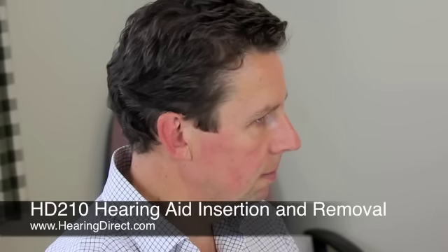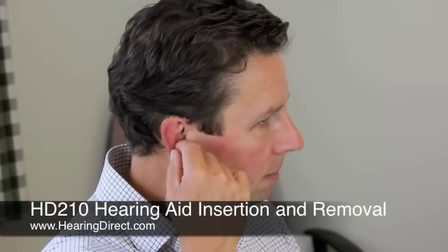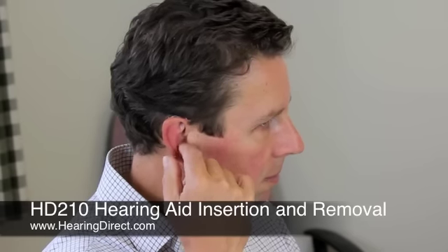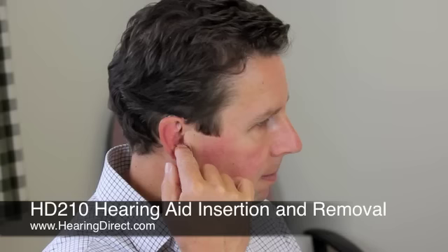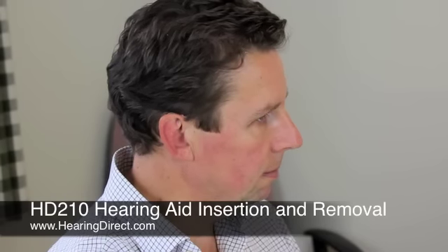The retention guard should also lie in the bottom of the concha. If it is slightly too long for your concha, simply cut it. To take out the instrument, simply pull on the tubing.